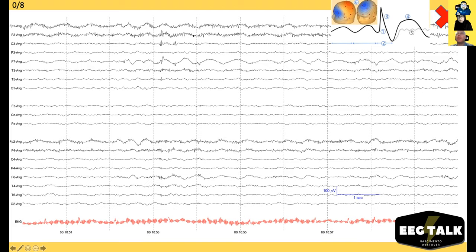The answers are already shown here. This first example — there's nothing right at the center, nothing spiky. There's no wave that has any asymmetry to talk about. You kind of have to have a sharp transient, and there's not even really a transient here. This looks like a randomly selected piece of background. We only look at the center — that's easy. Not a spike.